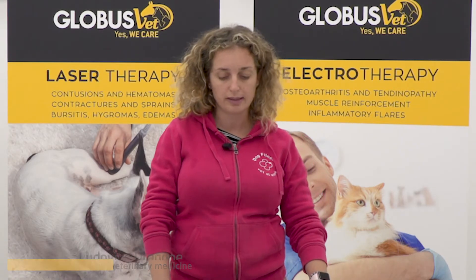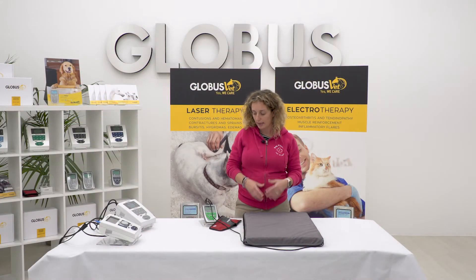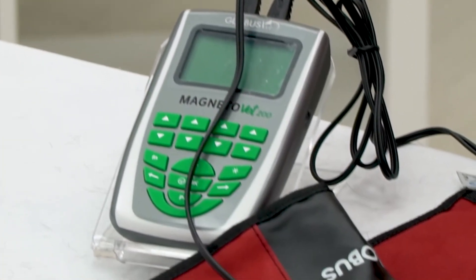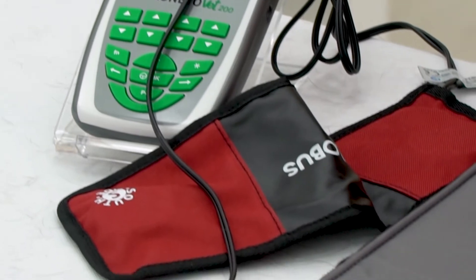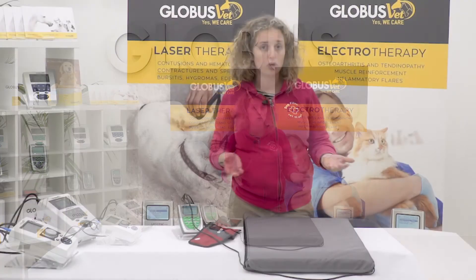When we talk about older dogs, when we find ourselves managing a patient of a certain age, we are dealing with a patient who has chronic problems that will last over time. An aid to our therapies can be the use of magnetotherapy, a method that is often given at home to owners, precisely because having long application times and being easy to manage, it can be used safely and comfortably at home.